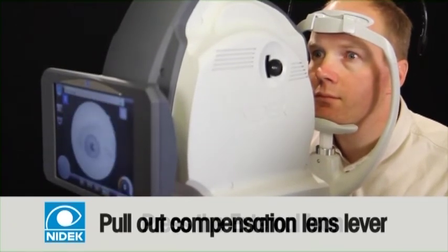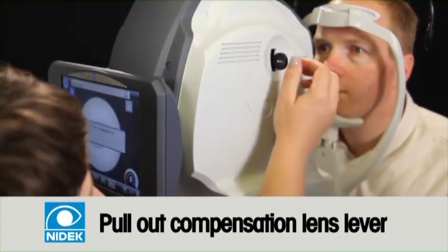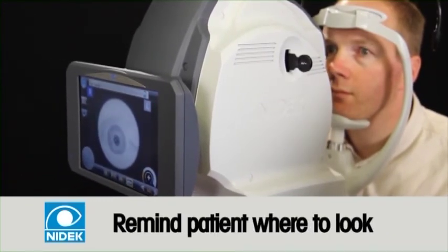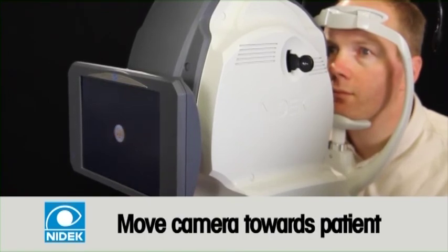The camera will prompt the user to enable the compensation lens. On the right side of the device, pull the compensation lever all the way out until it stops. If needed, remind the patient where to look. Slowly move the camera towards the patient until the image on the observation screen is in focus.